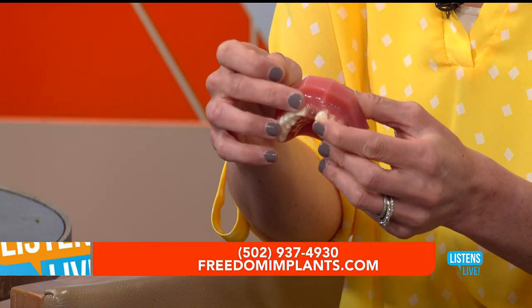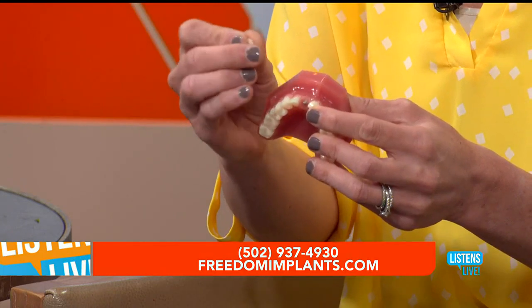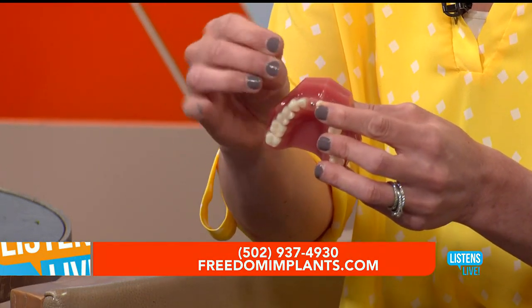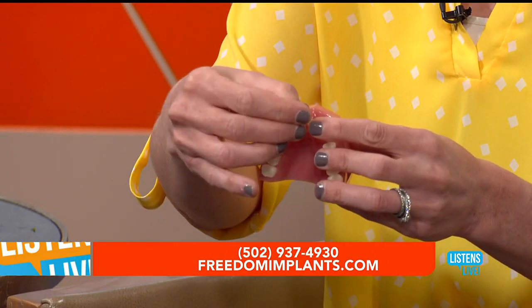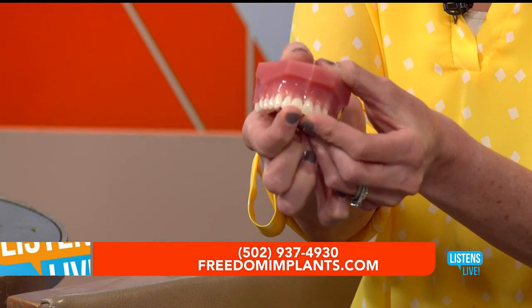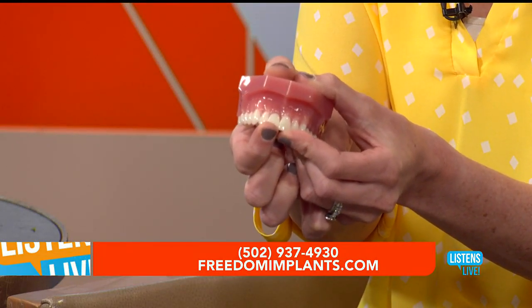So she walked out with no flipper. She'll come back in about 4 weeks, not months like the surgical ones, and we'll have her nice, pretty porcelain or zirconia crown, a much stronger material, cemented on permanently onto that implant. It doesn't come in and out anymore.